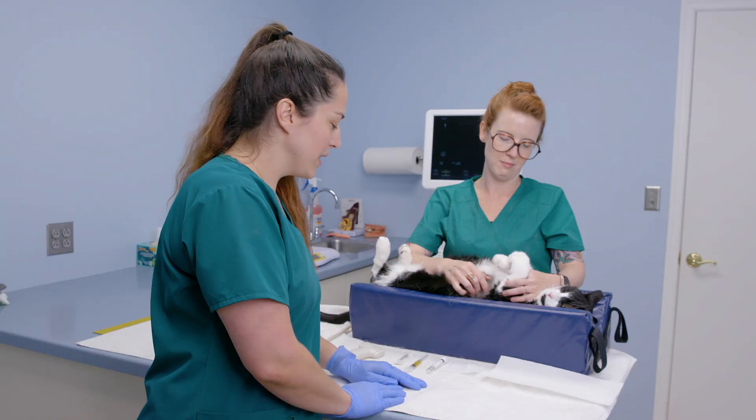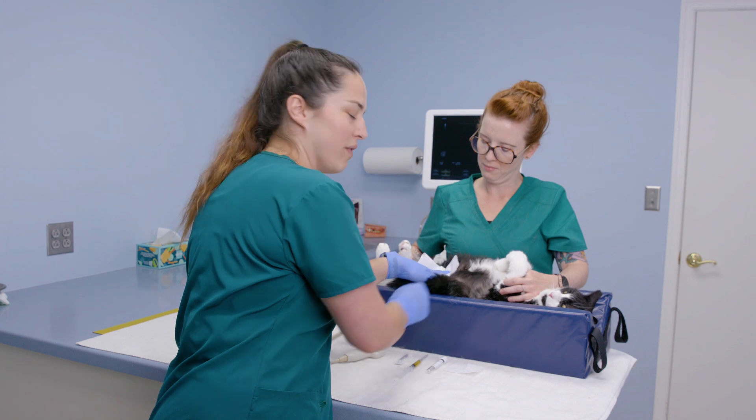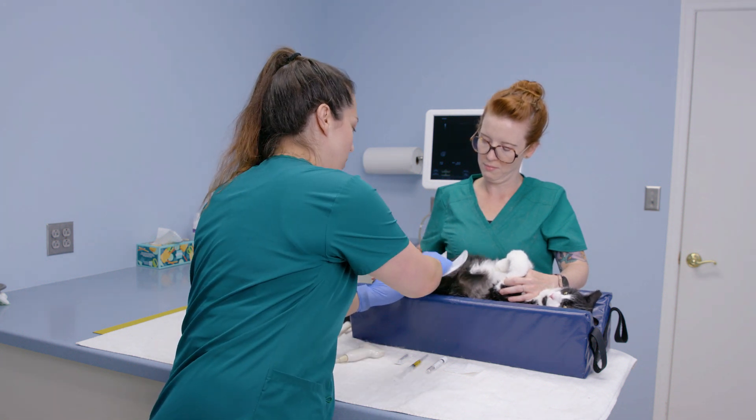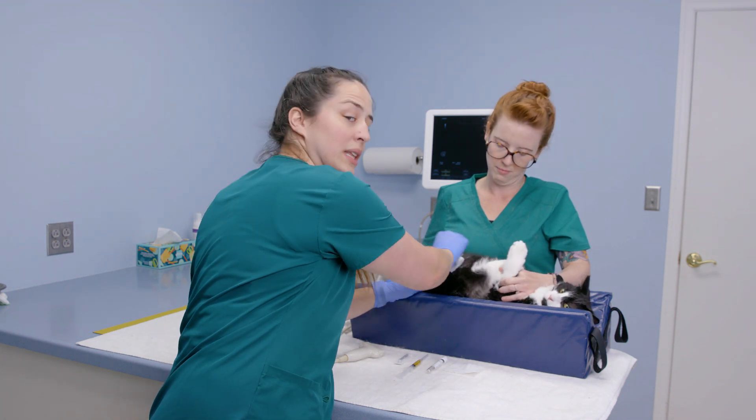Now that we've collected our sample, one kind thing to do for our patients is to dab off the alcohol from their abdomen, making sure we're getting all that residue off so they're not walking around wet and smelling like alcohol.